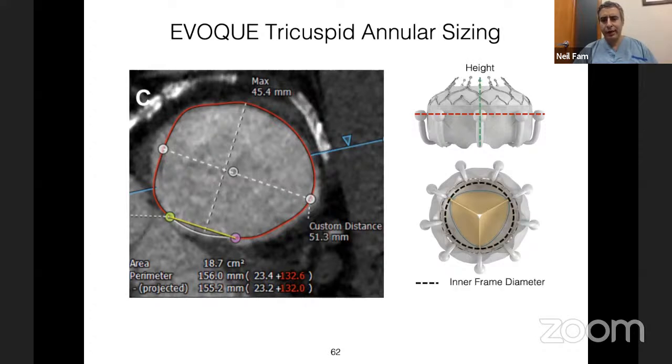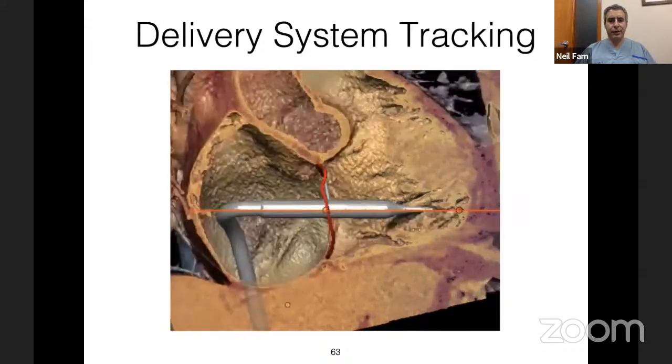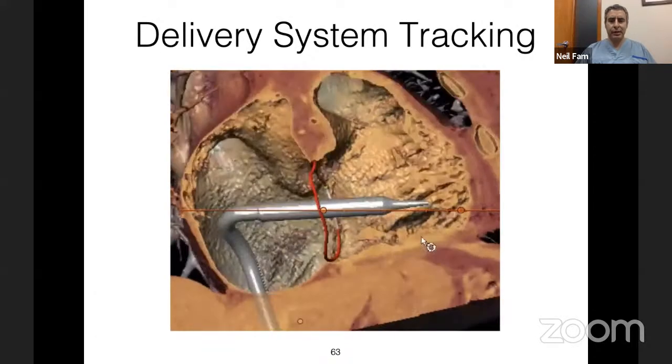So this valve has ventricular anchors and then a self-expanding annular stent with a valve inside. The valve is designed with a valve-in-valve option, such that down the line you can put in a Sapien 29 if there is a valve failure. So a lot of planning goes into these procedures. Unlike for TEER, the replacement devices are really all about CT analysis in addition to echo.